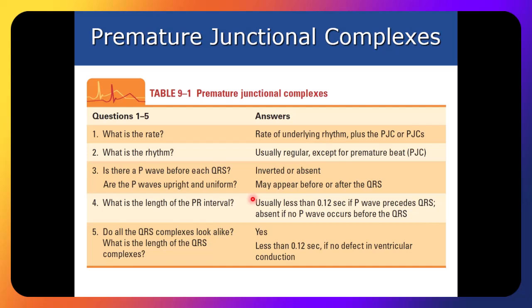In that situation, it is often in the eye of the interpreter. I may look at it and go, no, there's no PAC there. You may look at it and go, yeah, I think there is. If you measure out the R-to-Rs, that one's earlier. We both may be right, or we could both be wrong. The ultimate thing here, ladies and gentlemen, is to make sure that we're not missing life-threatening dysrhythmias for a patient.